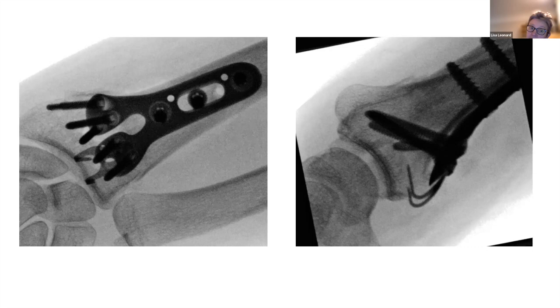And it's not as distal as the volar rim plate, which Synthes make, which is really quite clunky and thick, and you nearly always have to take it out. We have used both, and there's an example of both in the pack, but this is a neat little solution and a really nice reduction that my colleague Mr. Ray got. I haven't used this yet. It's quite new, and you don't need it that often, but it's another little thing in the armory.